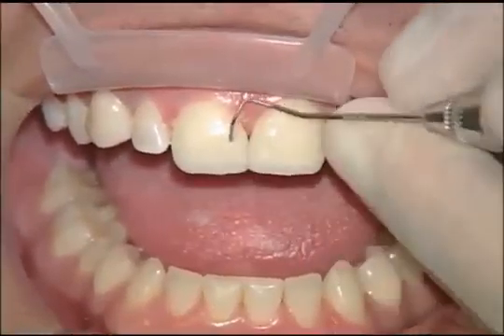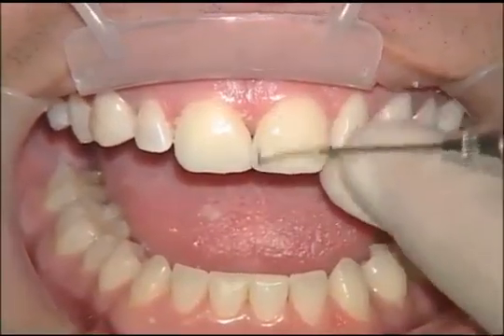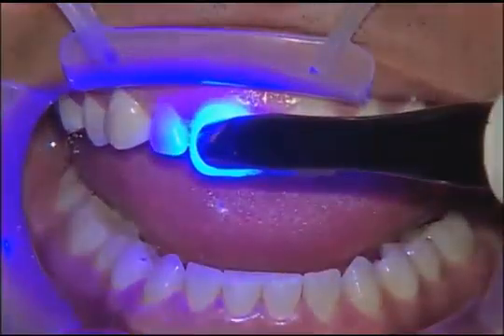And as you saw, we were able to work the floss in between the two teeth. It wasn't too tough on the distals because we did have some pre-existing diastema. Once we've cleaned up the interproximal cement and the facial and the lingual cement, we're going to go ahead and do a full cure on these two teeth.